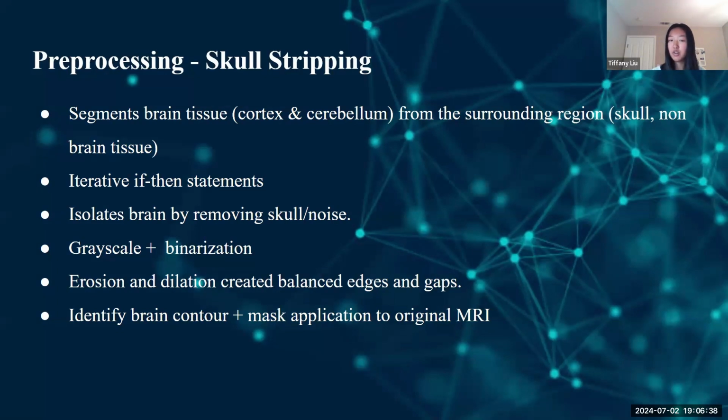And then the contours of the weighted image were blurred and combined, and when the medium blurred images were set, we identified the wanted contour by calculating the contour areas and choosing the largest area, which would be the brain contour. And the contour was used to make the final mask, which was applied to the original MRI image, producing the final brain stripped image ready for further processing.